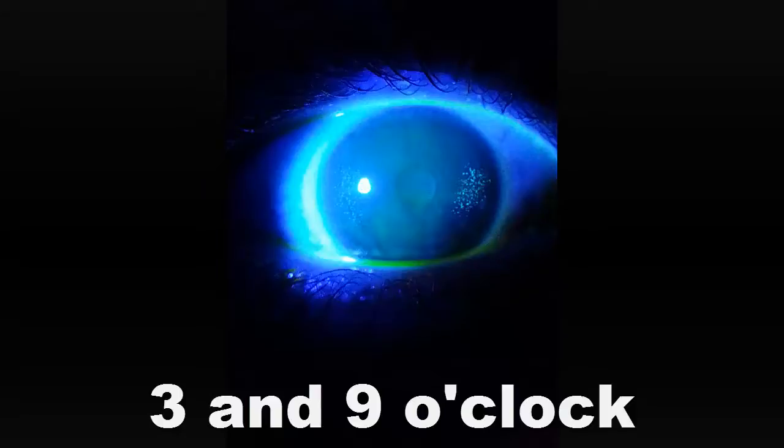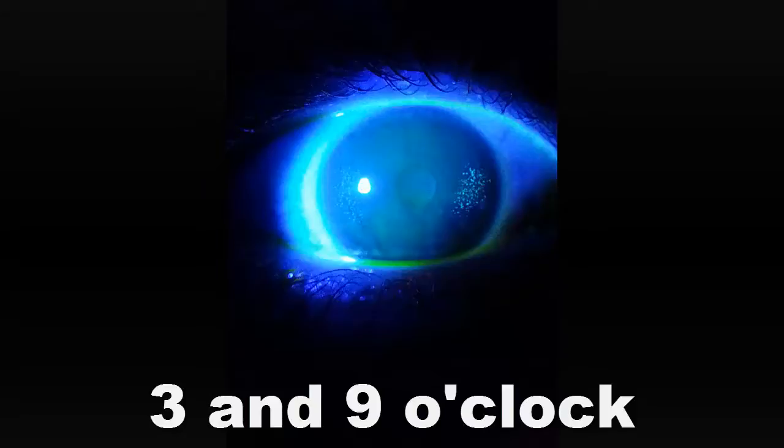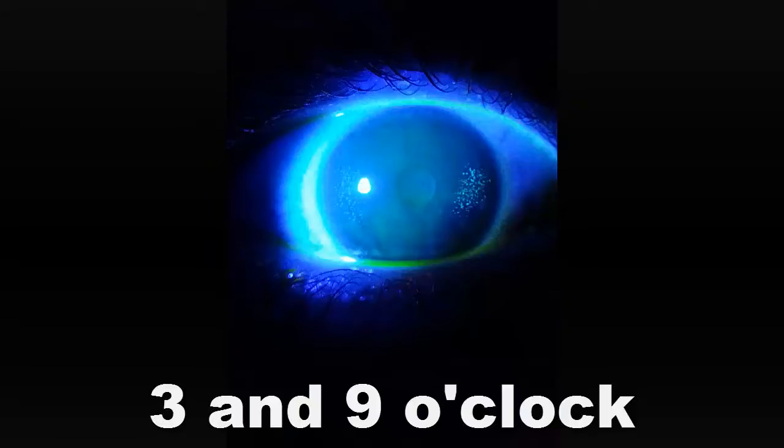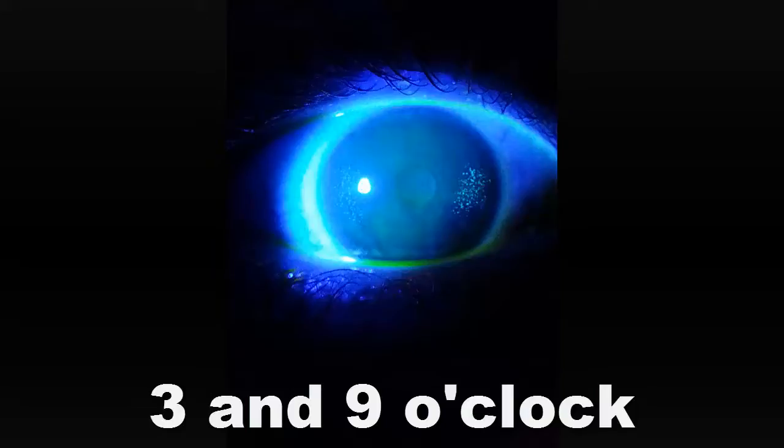How do you fix it? Re-evaluate the edges of the lens. You may need to adjust your diameter or periphery. Going to a thinner lens design often does the trick.